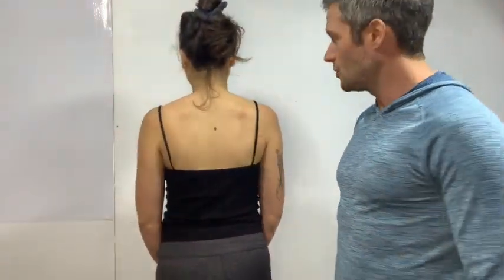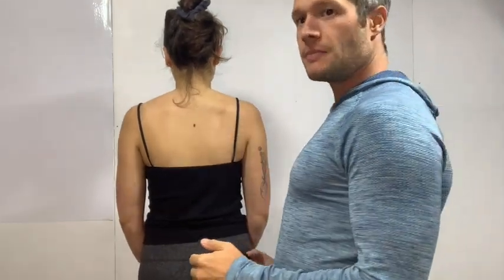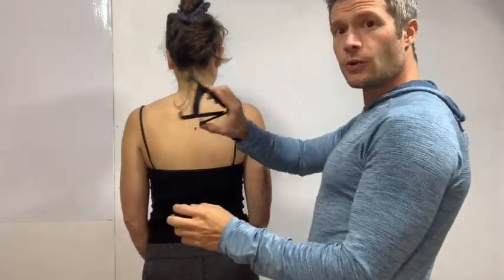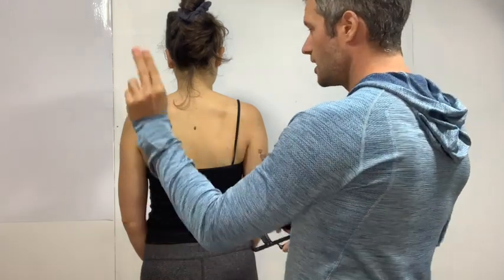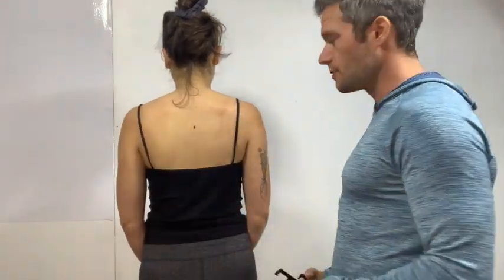So as far as the mechanisms of the Skinfold caliper itself, that's the way we'll be going. So I'll set the indicator farthest out. Then when you do the Skinfold measure itself, you want to follow a very particular order. So now if you can turn around, great, thanks. So we're going to do a scapular or shoulder blade measure. And again, you want to hold the caliper in your right hand and use your left hand to pinch, always working on the right side of the person's body.